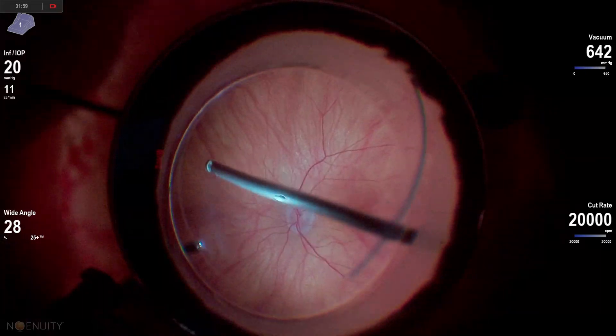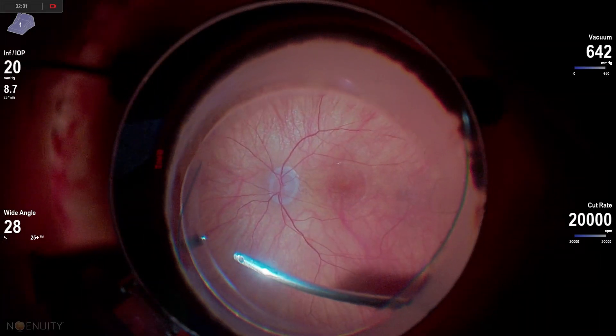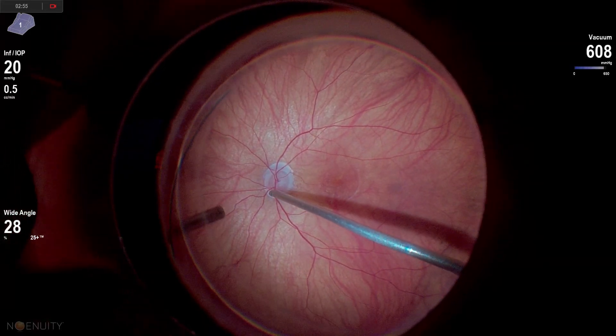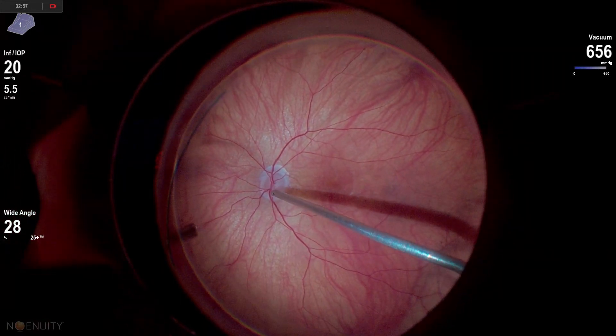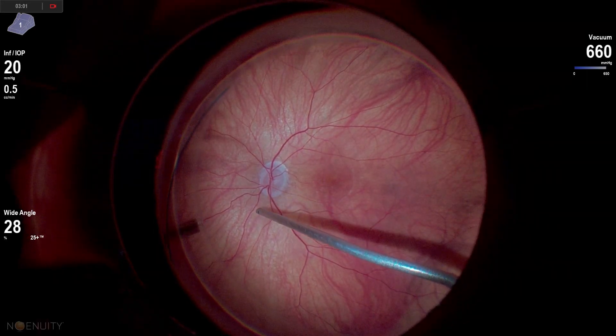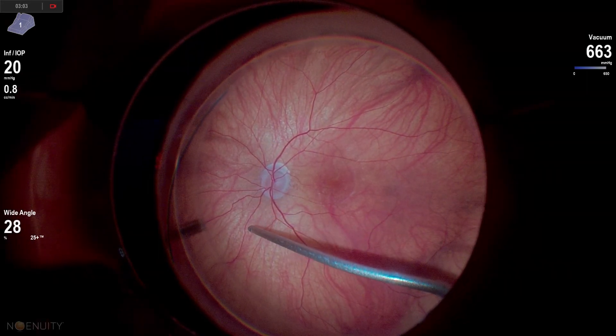It's not often that some basic things really cause me to struggle, having done this almost 20 years. But in this case of vitromacular traction, did I ever struggle with this posterior hyaloid and getting this vitreous elevated up.